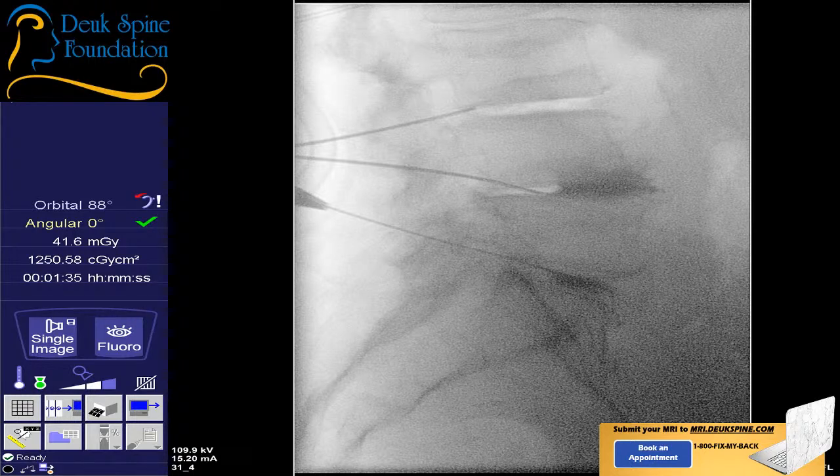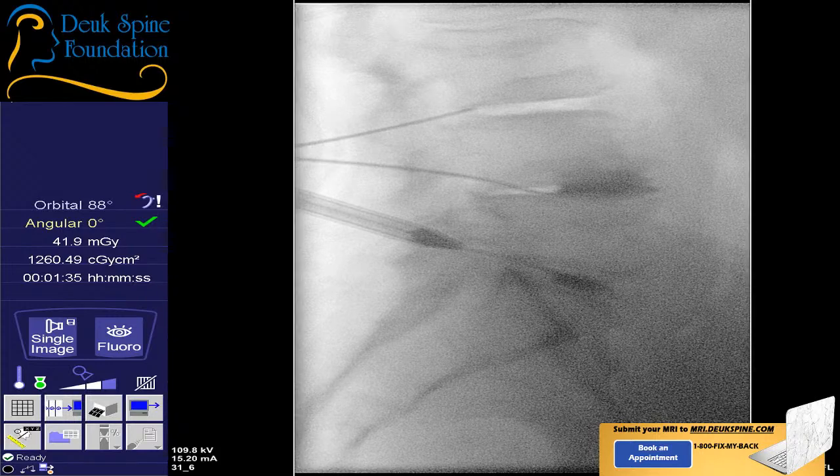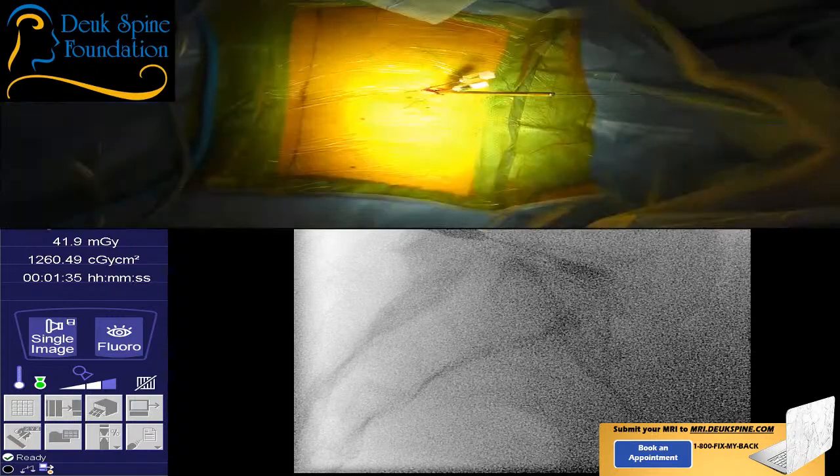So at this point we're bringing our dilator down. Blood pressure is perfect. Could be a little lower, but it's fine where it is. It's 110 systolic. It's nice. Shot. And we're navigating past all the arthritis, the facet joints, into the foramen, and I know that we're in a safe place. I just don't like that sacrum.